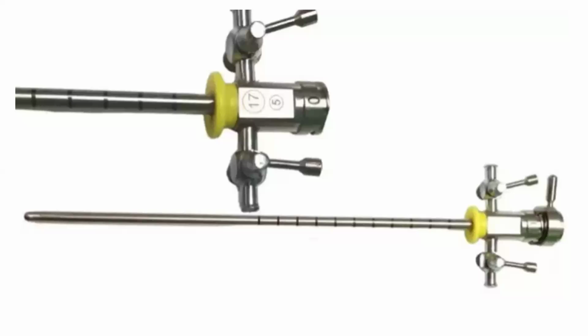Then what is the length of the instrument? What is the size? What is the shape of the front? So there is a beak in the front of the sheath, sir. And being a 17 French sheath, the beak is smaller in length, around 2 centimeter, and the color coding is yellow.